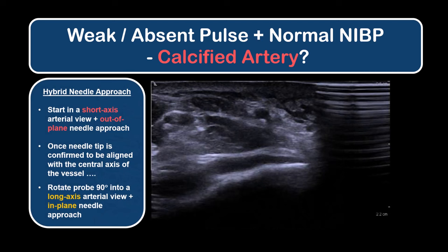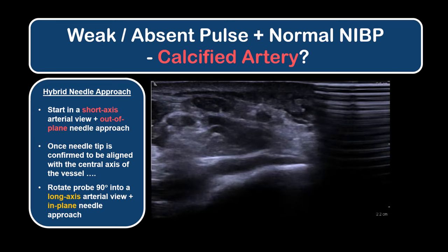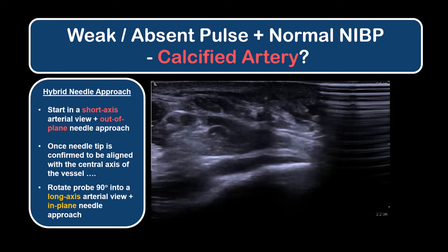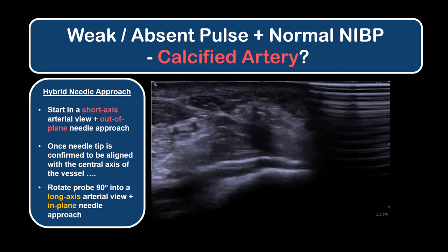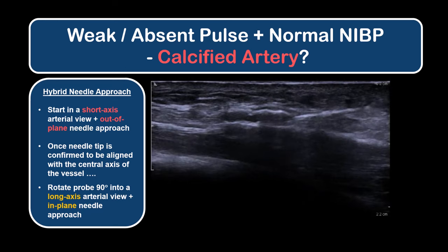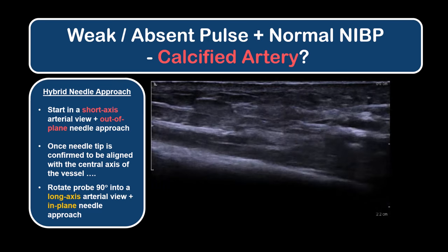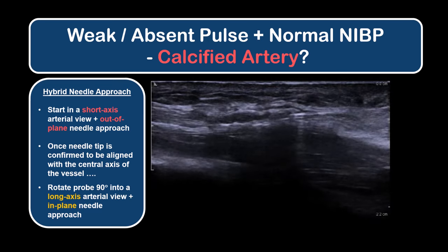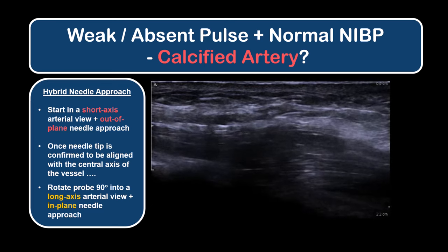A hybrid needling approach can also be useful. The out-of-plane short axis view is used to ensure that the needle is advancing in the central axis of the vessel. The probe is then rotated 90 degrees to an in-plane long axis view to adjust the trajectory angle and to help guide the cannula into the lumen, which is narrowed by calcification. This also minimizes the risk of piercing the back wall and going through and through.